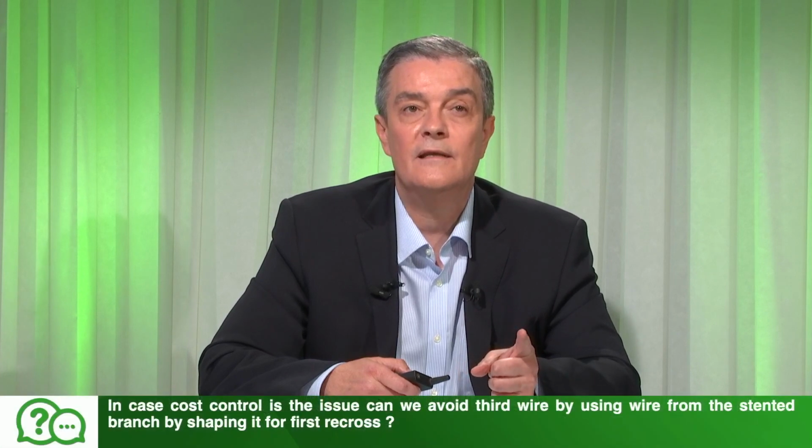Yeah. A few more practical technical questions. In case cost control is the issue, can we avoid the third wire by using the wire from the stent in the branch?